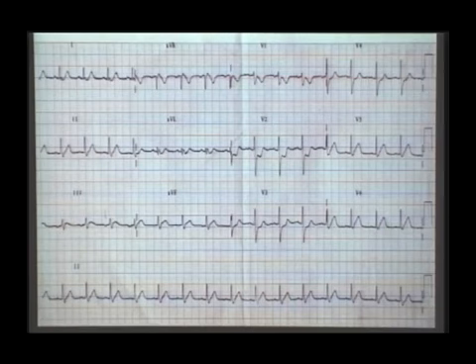So just compare the segments between, you see that you can compare it nicely here. You see that ST here, V3, you see that ST here. So that is the earliest sign of very early hyperacute phase of subepicardial injury, a slope elevation of ST segment. So that's why I told you, for a chronic old inferior wall infarctions, I asked you to look at V1 to diagnose a tall R wave for posterior wall infarction. Whereas in all acute inferior wall infarctions, where there is a ST elevation in inferior wall, you must also look at V1, V2. For what?